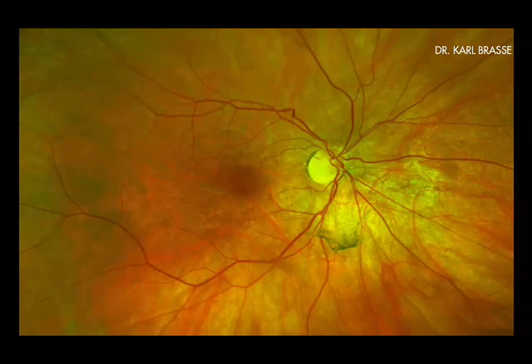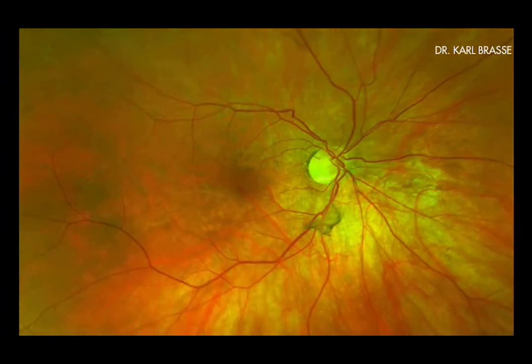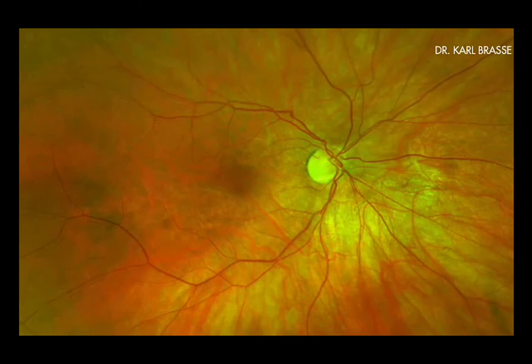This is a case of a myopic patient suffering from a giant Weiss ring floater. It is a really ideal indication for YAG laser vitreolysis. Patients are almost always free of symptoms after the treatment. But unfortunately, the success rate overall is by far not as good in other cases. Please note that not all vitreous floater patients are candidates for the laser treatment.